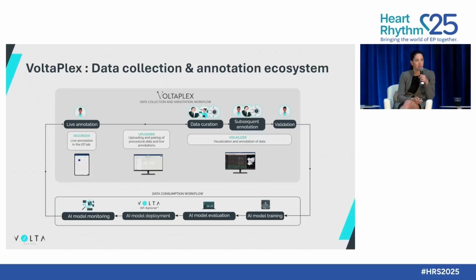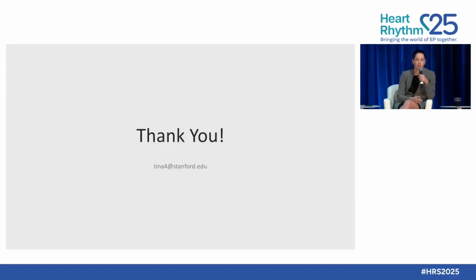So this is the final platform. There is live annotation during the cases. There's an uploader that can then upload these cases, not just the signals, but the 3D anatomic maps, all your annotations about the signals. And then other experts can continue to re-annotate those signals and reanalyze what is more important for us. Is it just the signals? Can we tag termination sites? Can we highlight patients who have better outcomes? And then you keep training the model, evaluating the model, and update the model every year with hopefully better outcomes. That's what the system is. Thank you.